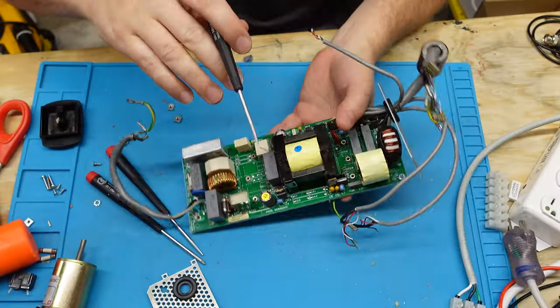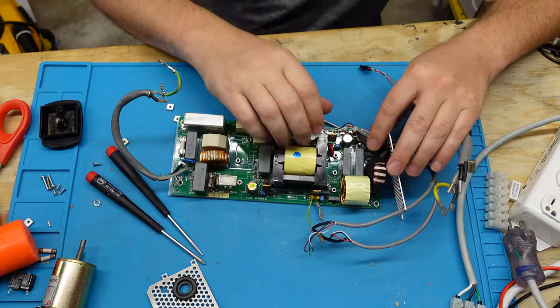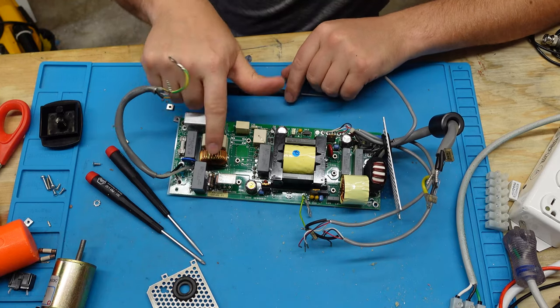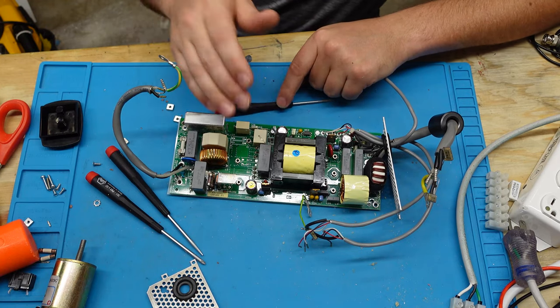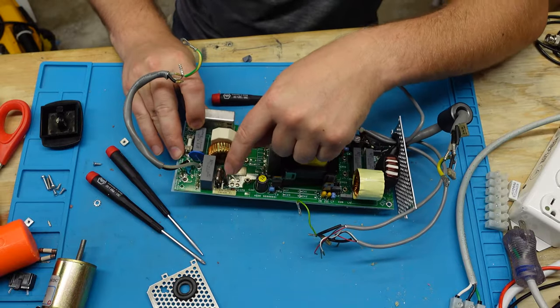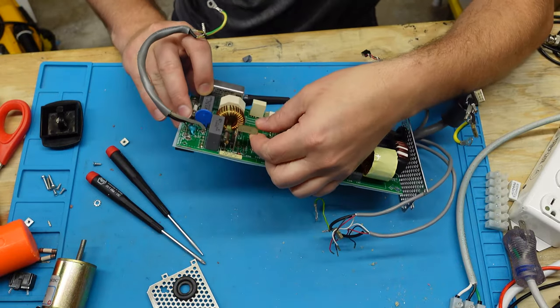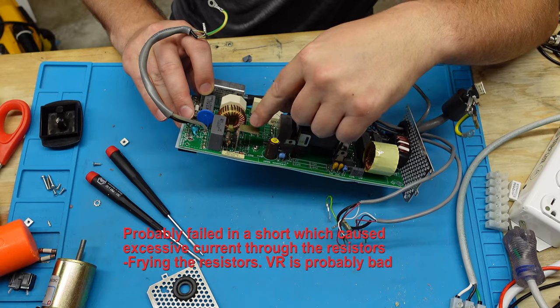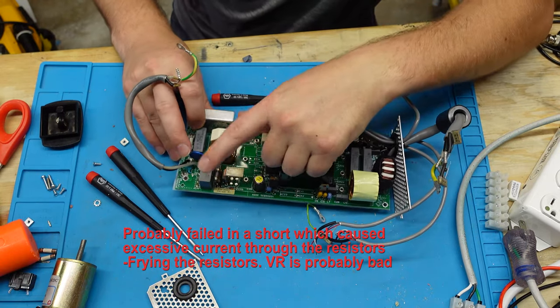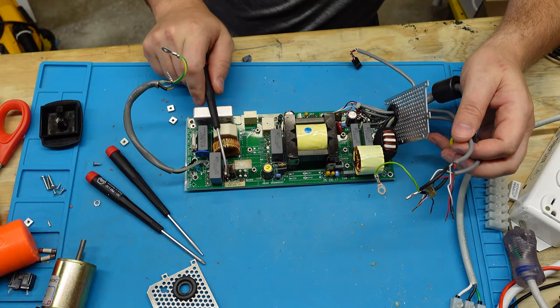Here I was thinking all this time that it was going to be over here on the output side. But come to find out, that is almost certainly the problem here on the input side. And so, since they're so close to this voltage regulator, and this voltage regulator does look like it's gotten hot throughout its life. So yeah, that's your AC power side.